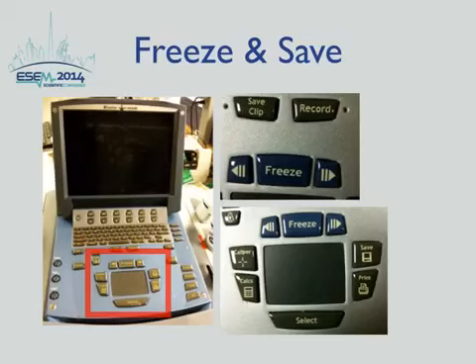So these are the 5 basic buttons that you can remember and be familiar with to help you with getting good quality ultrasound images. In the next few slides, we will review the number of ultrasound transducers and the difference between these transducers.